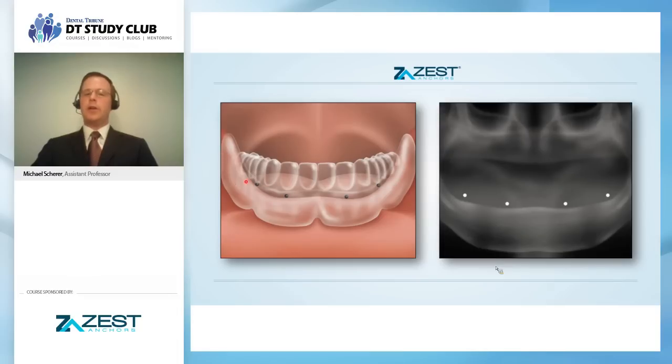Now this shows a very classic approach to diagnosis and treatment planning with a panoramic radiograph. Using ball bearings, or BBs, of certain diameters, you can say, yes, my BB is 4.5 millimeters in diameter, so right at this vertical height, I can make an estimate based upon 4.5, 4.5, 4.5, etc. It's a very classic way to do it, but there are better and more efficient ways to do it in the year 2014. However, this is an oldie but still a goodie.